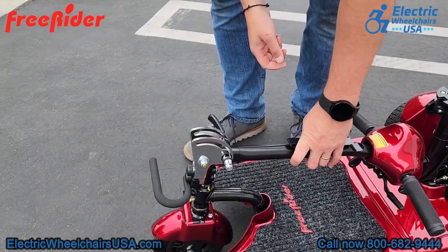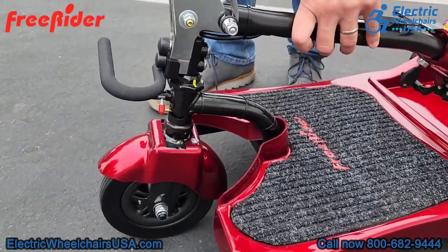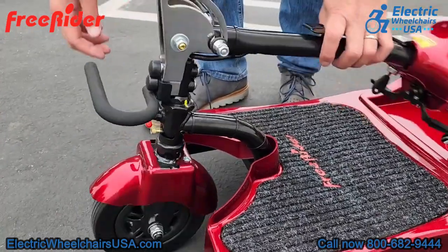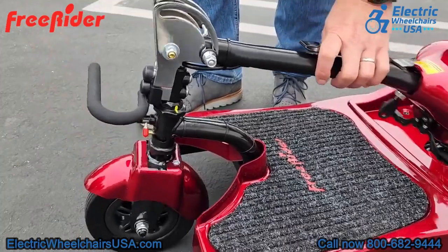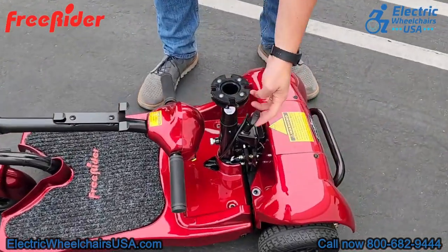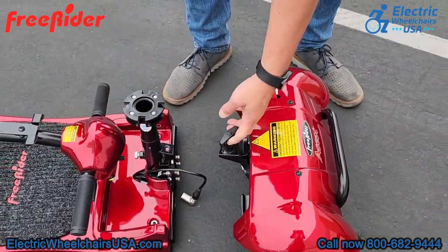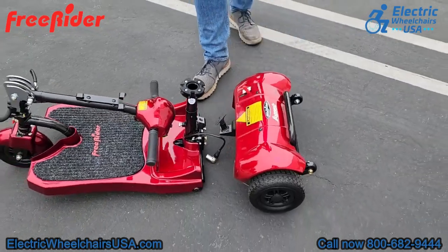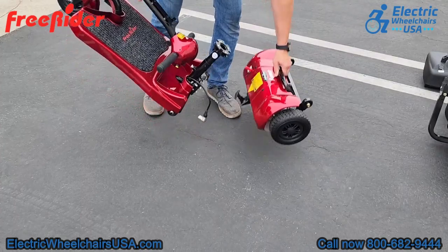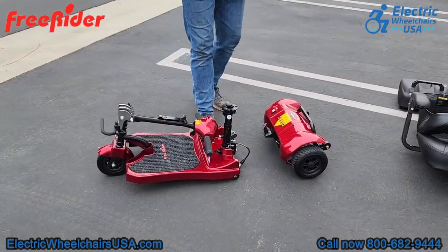There is a knob on the front of the tiller that you lock into place so it does not jump around while in transit and to prevent damage. The last step is to pull up this knob, which will separate the rear wheel axle from the front half portion of the scooter. Once disassembled, the heaviest piece is the front half portion, which weighs only 26 pounds — so it's really simple to transport if you're capable of lifting 26 pounds.